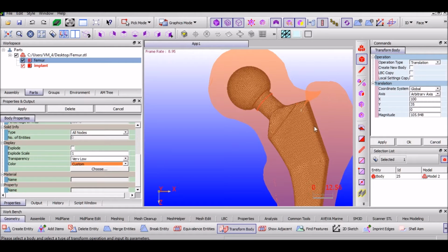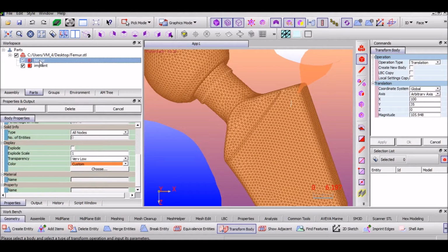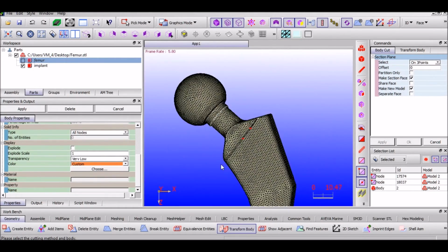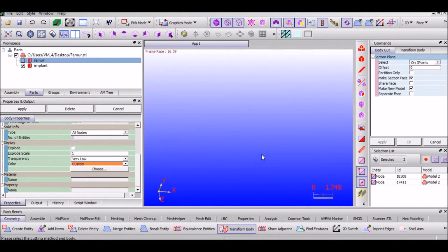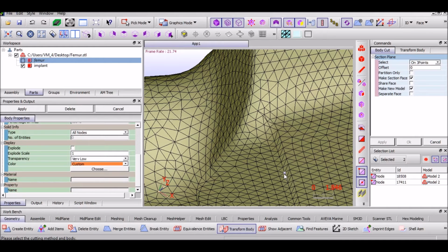The next step here is to perform a body cut so as to remove the femoral head. Therefore, go to body cut, select on 3 points, and now mark 3 points along the neck of the femoral implant. I have marked 2 points on the same side. Now I need to flip the body in order to mark the third point on the other side. Select the femoral body and click apply.